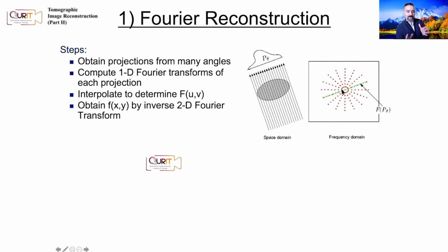And notice, for those of you who are familiar with MRI, this is actually what we do in MRI exactly, right? So in MRI imaging, you're trying to sample the Fourier domain. There's different algorithms. You could do a spiral sampling and filling of the Fourier domain. Like you could start from here, and given your specific MRI sequence, you could do a spiral, or you could do different approaches. There is a way, even in MRI, to do radial sampling of the Fourier domain, which is equivalent to what tomography in a nuclear medicine sense, in a radon transform sense, is doing. So there's a nice parallel there between MRI and this kind of problem that we're tackling.